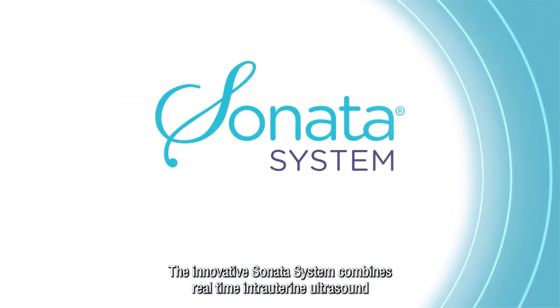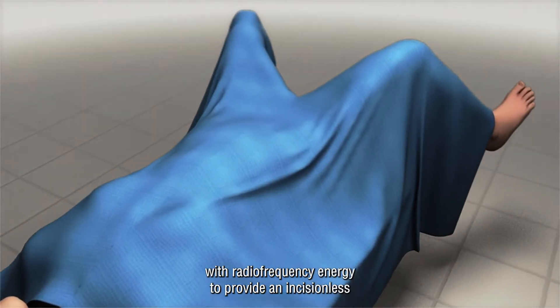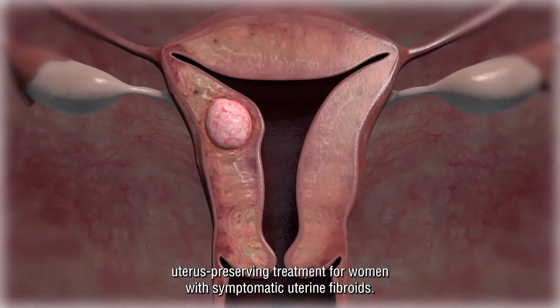The innovative Sonata system combines real-time intrauterine ultrasound with radiofrequency energy to provide an incisionless, uterus-preserving treatment for women with symptomatic uterine fibroids.